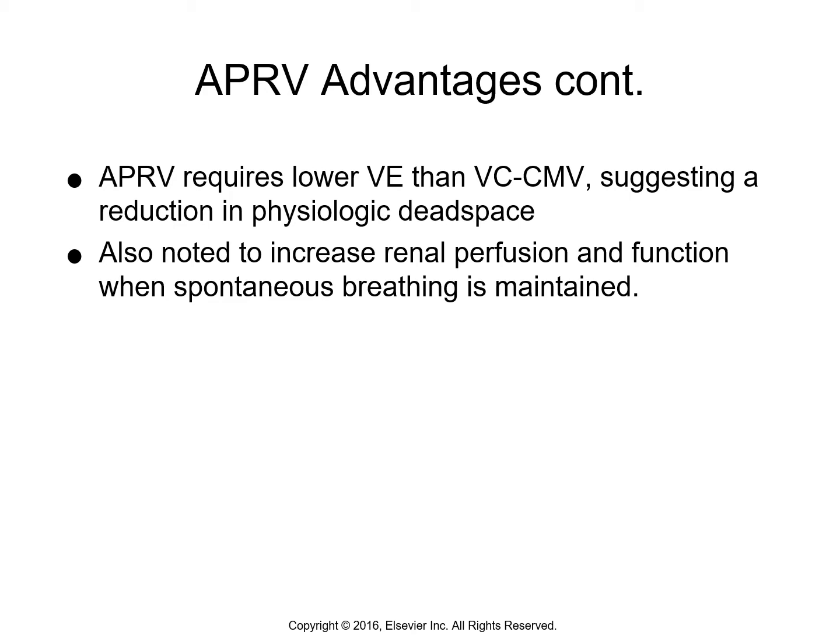Also remembering, I just said about keeping that renal perfusion going when spontaneous breathing is maintained. So the other beauty of having the spontaneous breathing happening is that it helps prevent atelectasis by having the diaphragm be active. Okay, and this might also help prevent atrophy of the diaphragm. So that's a really important thing, why they want them to still be able to breathe spontaneously so the diaphragm doesn't waste away.